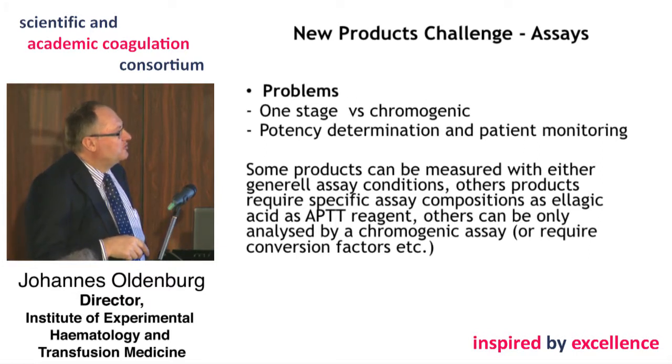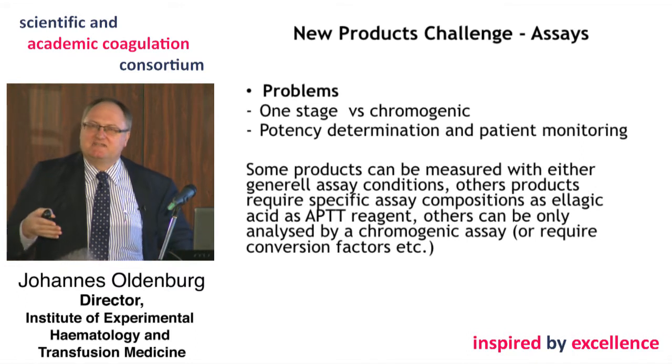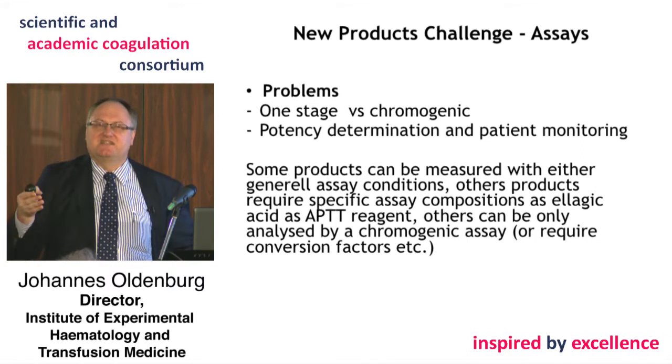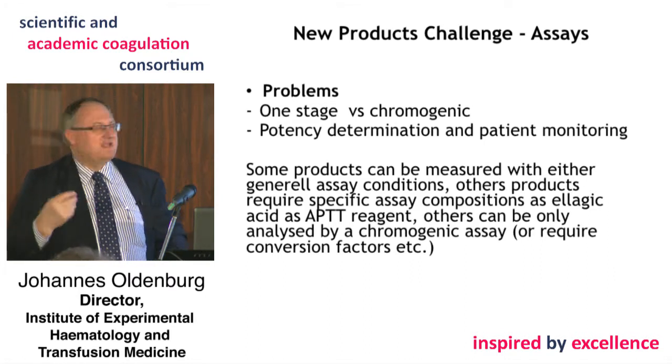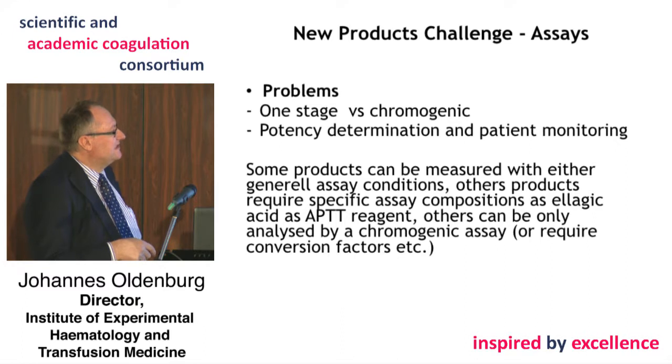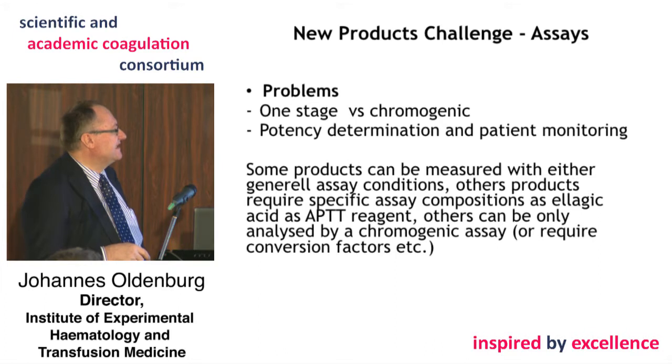And if you go through these new products that are now available, the fusion proteins, the modified sequence factor VIII concentrates, the pegylated factor VIII concentrates, some of these products can be measured with either assay, so with the one-stage and the chromogenic assay.